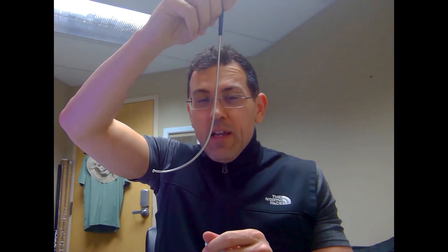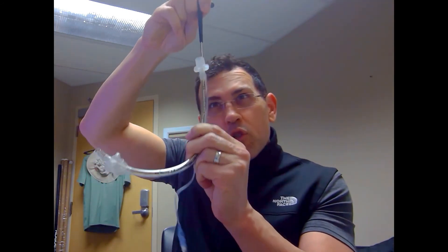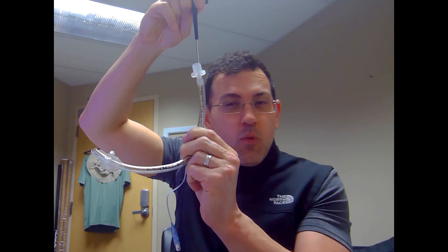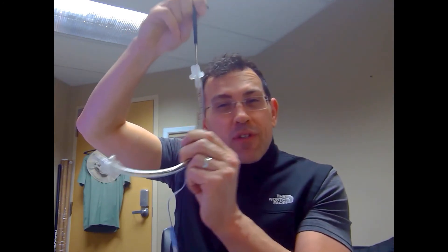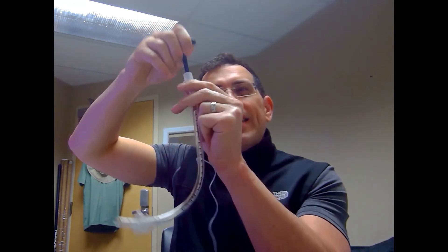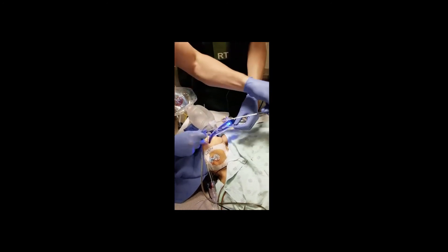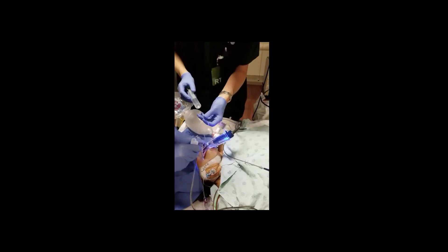Now, with the ET tube in the patient, we need to remove the stylet. It's not easy because the rigid stylet is very curved. If you simply try to pull straight up as you might with a non-rigid stylet, you'll meet resistance. The key is to follow the curvature of the stylet and rotate it toward the patient's chest and abdomen as you pull — and then it comes out smooth and easy.